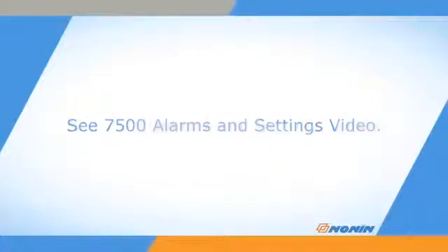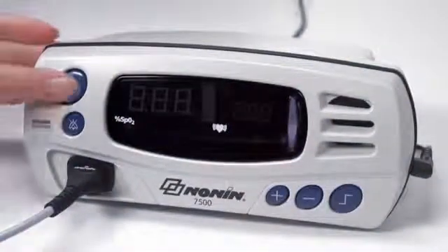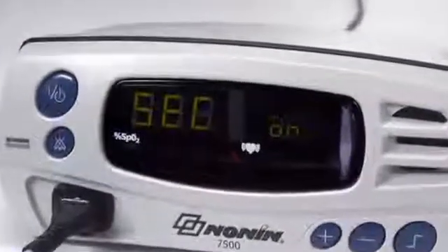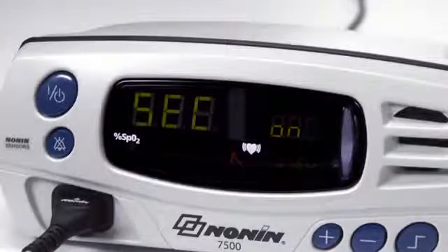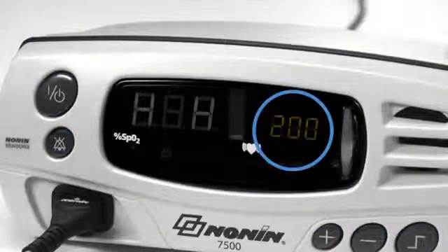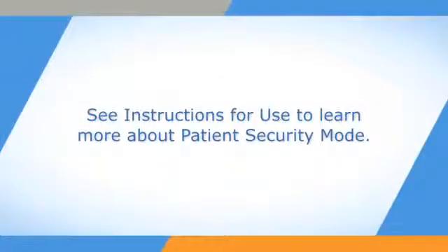A patient security mode may be set to prevent changes to alarm limits and a number of alarm and functional settings. When the Model 7500 is turned on in patient security mode, SEC ON is displayed and three informational tones sound. The upper alarm limits are then displayed, followed by the lower alarm limits. Refer to the instructions for use to learn how to set or cancel patient security mode or reprogram settings.